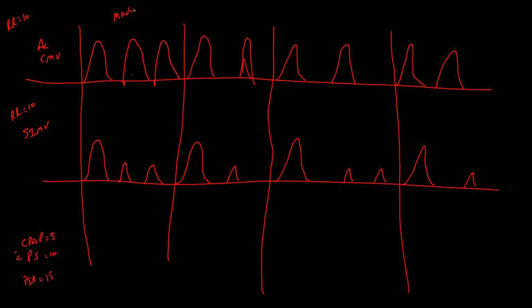Okay, machine-driven breaths, meaning that the machine is doing all the work. Right. So you'll set a tidal volume and the machine gives it to them every time, regardless of whether they instigate it or not, right? Exactly. You are perfect on that. That's right on target.